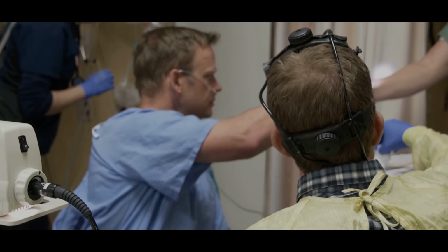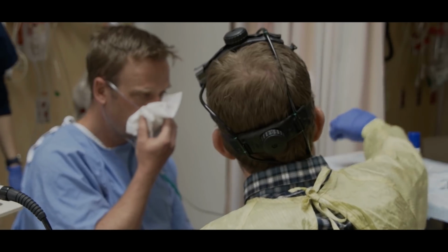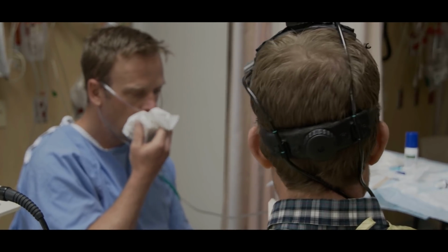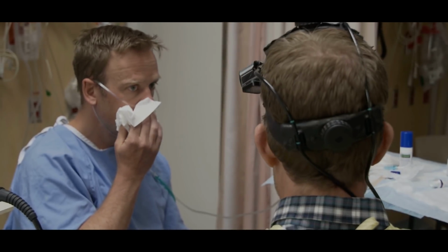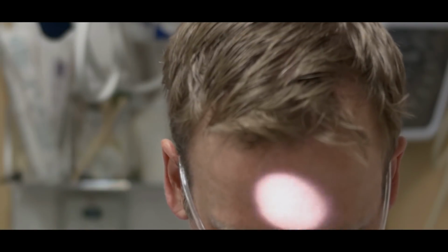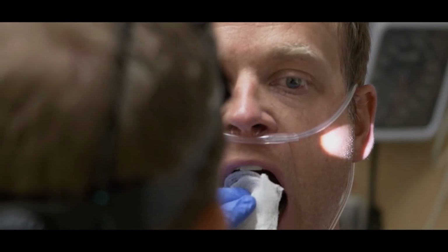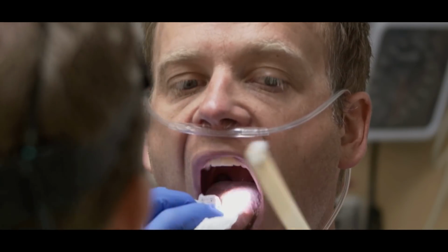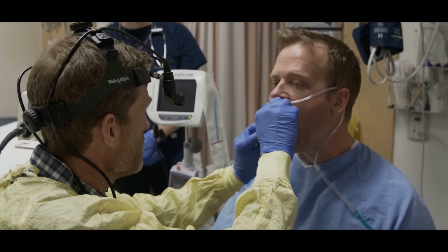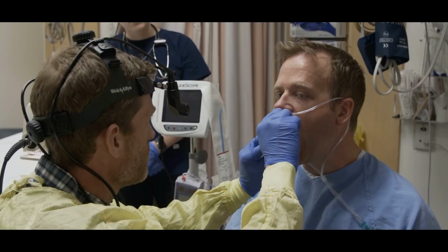So just going to go back and we're going to pull that tongue out. I literally pushed right through Chad's uvula to get it back there, and there was no response. So he's getting some good anesthesia here. We're going to trap the tongue, pull it out as far as we can. If you can stick that tongue out, and then I'll take it. Now you can relax the tongue once I grab it. And I'm just going to continue with just a little more of this. See if we can get that down just a little more posteriorly.